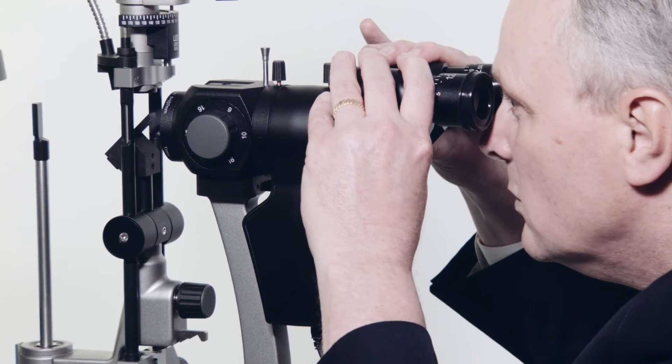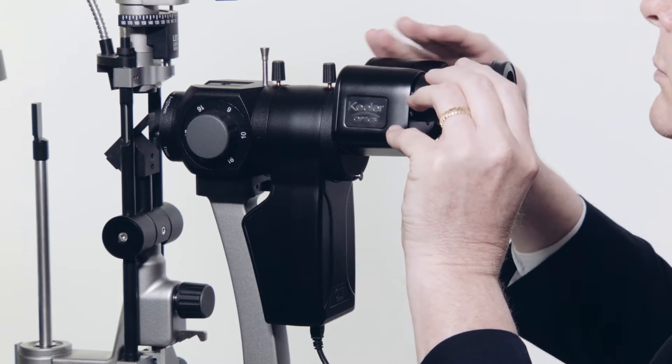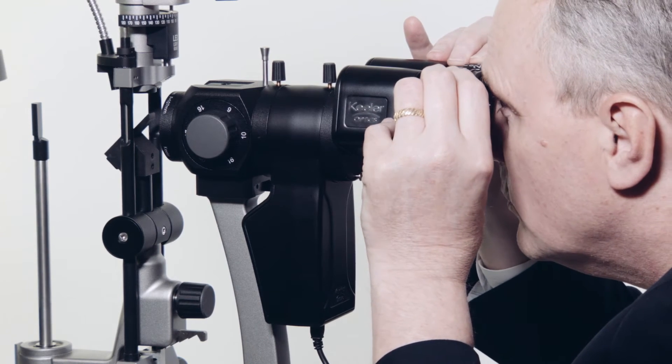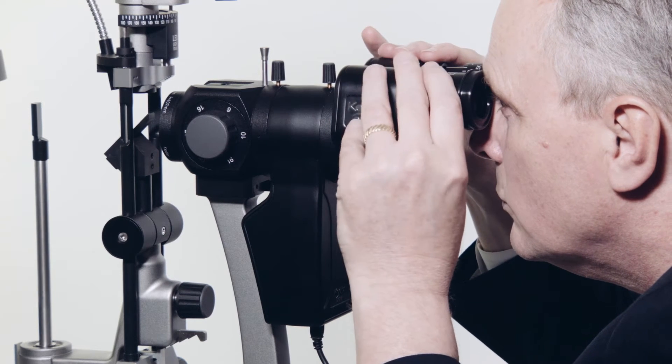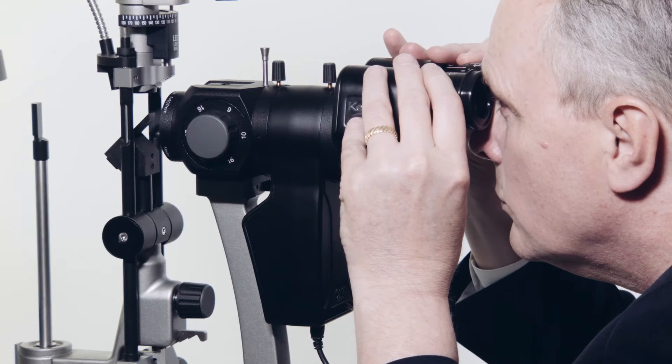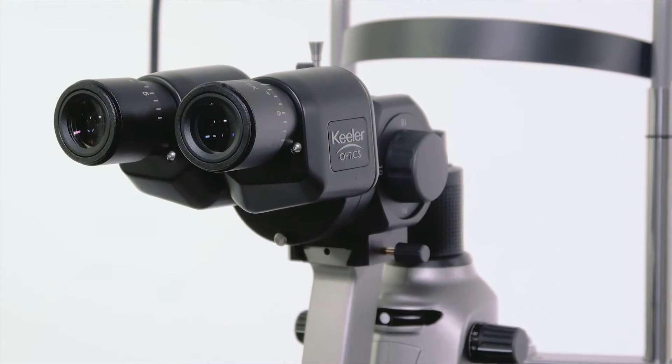Before using the slit lamp for examination, adjust the eyepiece's pupillary distance. Start with one eyepiece, rotate it inwards or outwards until a single fused image can be seen. Then repeat for the other eyepiece. The PD ranges from 49mm to 77mm.